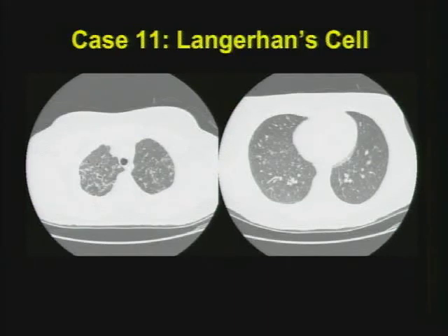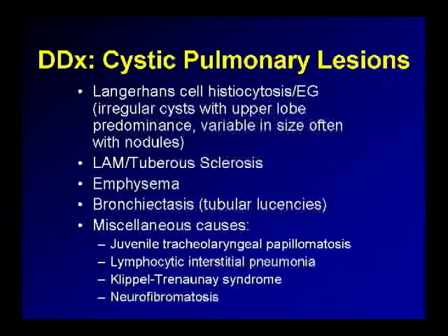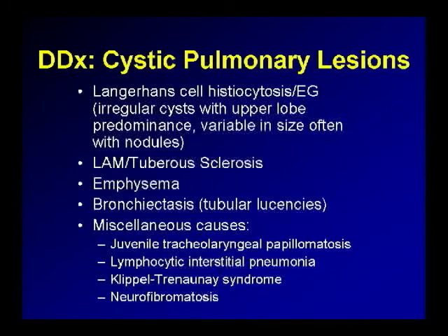Case number eleven: Langerhans cell histiocytosis — or as the old guys say, EG. Irregular cysts in the apices — notice how irregular the margins are of these apically predominant cysts. Cysts of variable size, very irregular contour, and favoring the apices should make you think of Langerhans cell histiocytosis. The differential for cystic pulmonary disease includes LAM (lymphangioleiomyomatosis), emphysema with superimposed interstitial edema, bronchiectasis, and miscellaneous causes like juvenile tracheolaryngeal papillomatosis. If you have the right history — HIV or autoimmune disease like rheumatoid arthritis — consider LIP, lymphocytic interstitial pneumonia, which can present with cysts or small nodules.